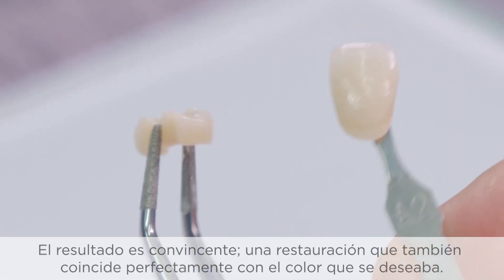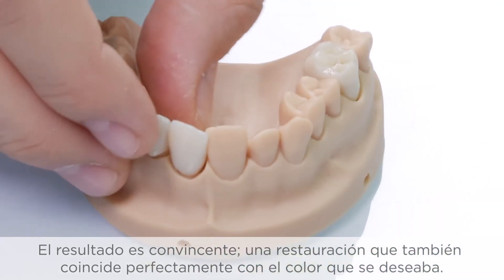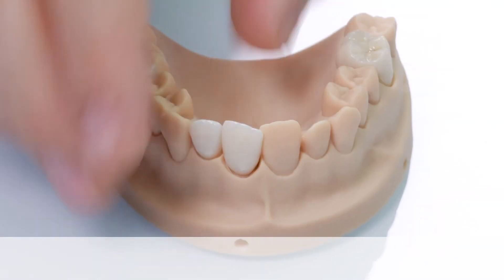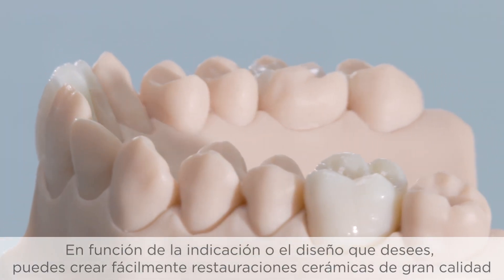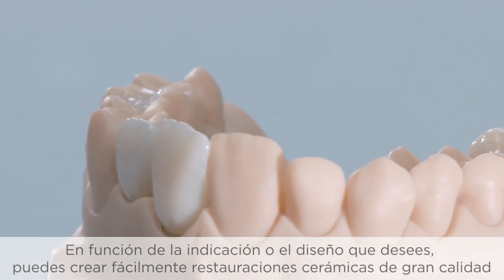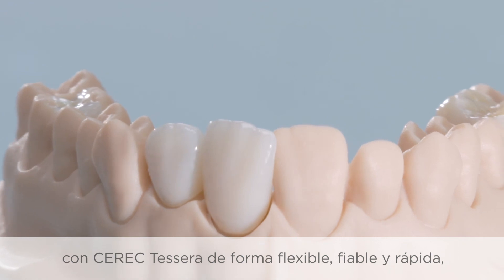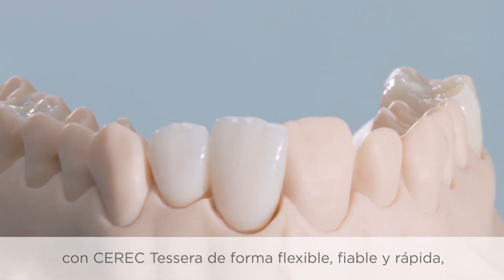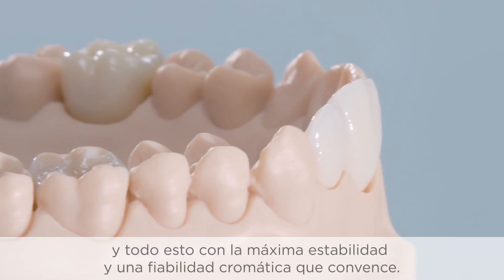The result is convincing — a restoration that also perfectly matches the desired target shade. Depending on the desired indication or design, you can easily create high-quality ceramic restoration elements with CEREC Tessera in a flexible, reliable, and quick way. And all this with maximum stability and convincing shade reliability.